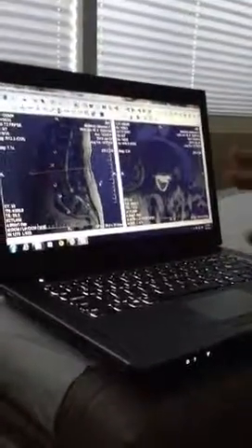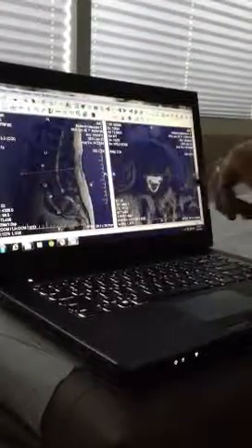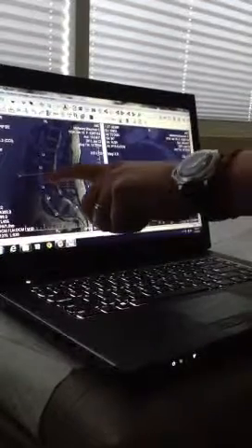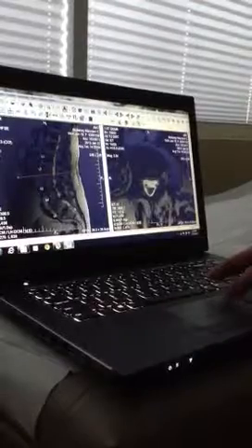This view is going to be our template, our guide, but we want to focus on this view over here. So, now we have to be careful. Why do we have to be careful? Because notice how the line here, the fuchsia color that you're seeing, is not at the level of the disk space. It's at the level of the bone. So we're going to go back up to the disk space.